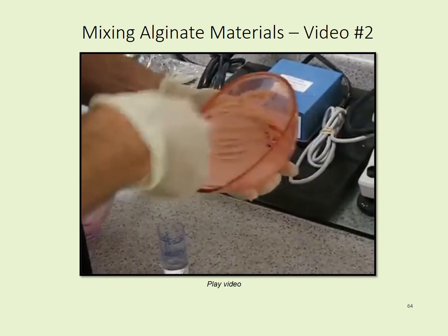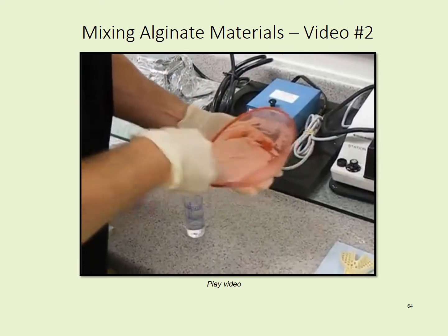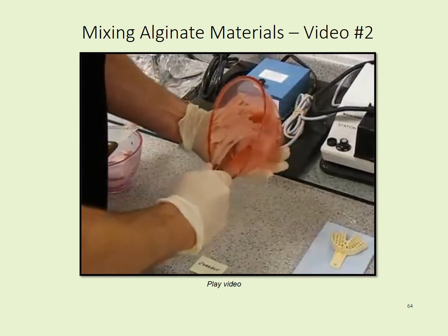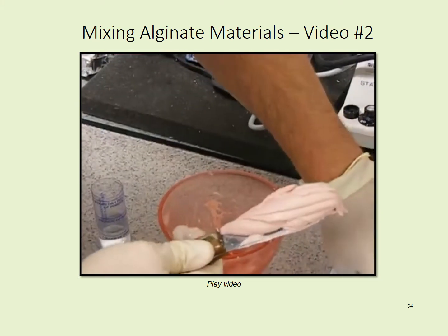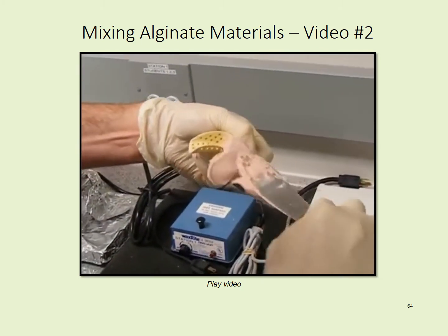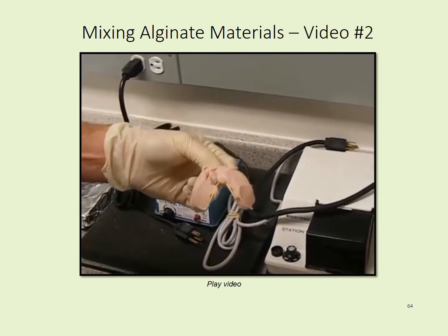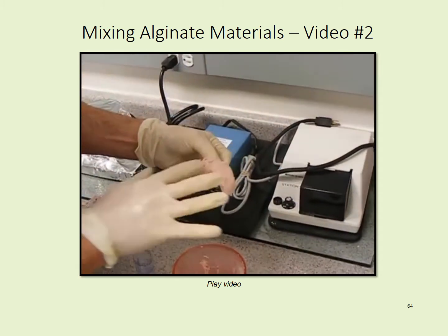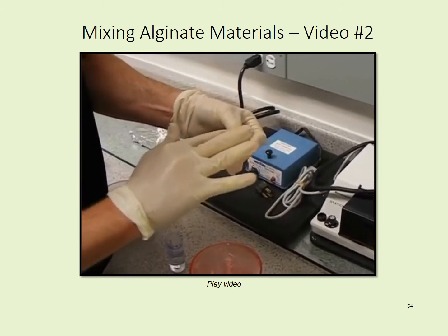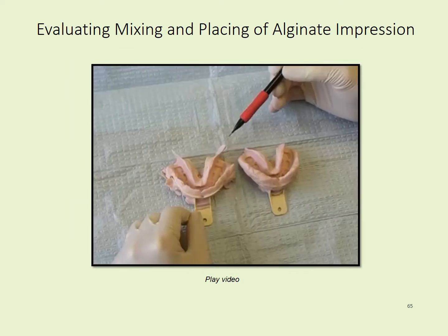as we spatulate the material, we spatulate it into one spot, making sure they pick the material up. Thoroughly spatulate it. When we're done and we're ready to put it into the tray, make sure that you load it in at an angle from both sides. Once you've done that, you can then dip your finger in water, come up and put a nice, smooth, glossy moisture barrier on the impression. And that is the proper way to mix.